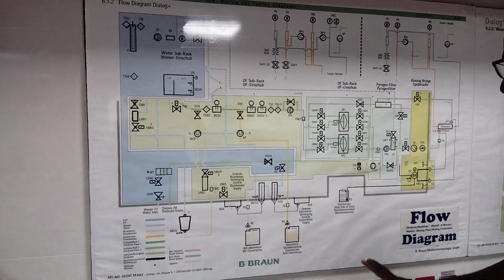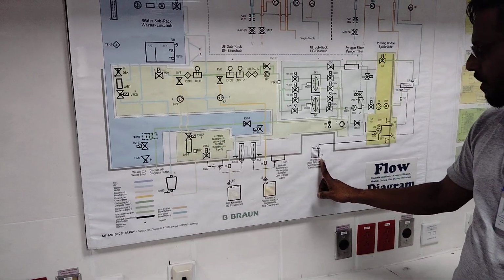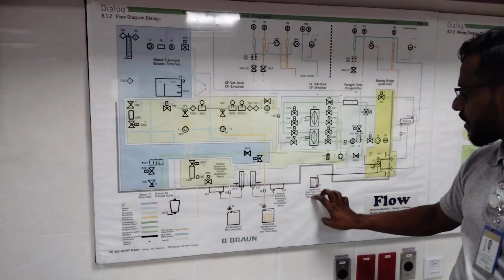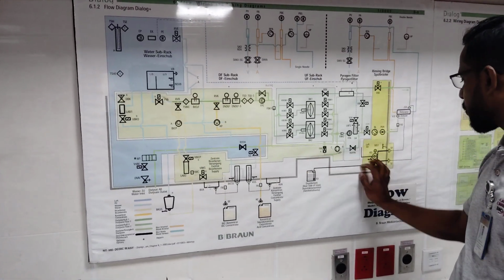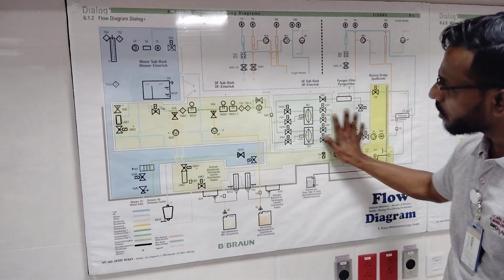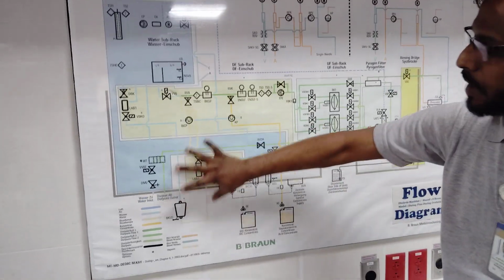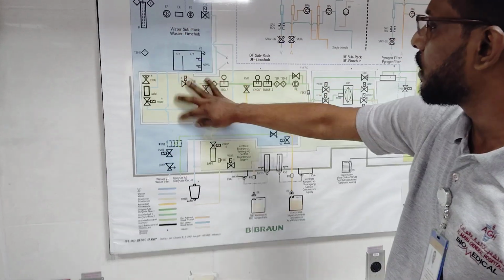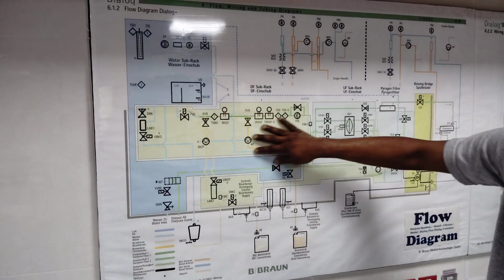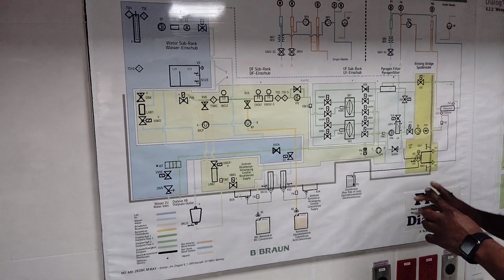This is the normal time. During disinfection time, there is disinfectant. We call it citric, and we have it at the back of the machine. This is called citric. During disinfection only, this part will be active. It will pull the solution inside and through this rinse bridge, then circulate it everywhere in the machine for disinfection. During dialysis time, it will take water from here and get ready for the fluid. The DF preparation will be here. Then it will start the dialysis through the dialyzer and do the dialysis procedures.